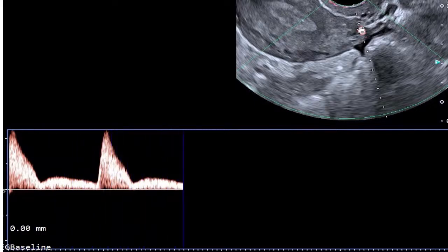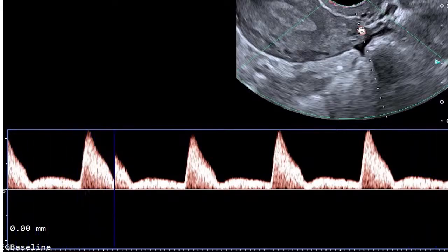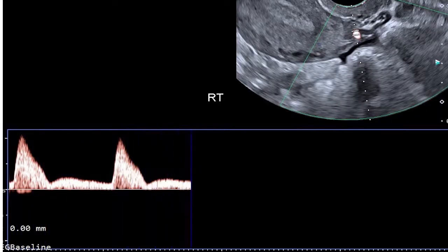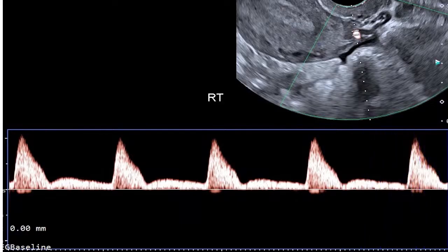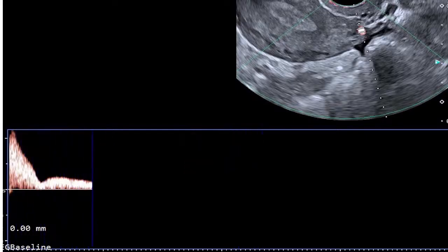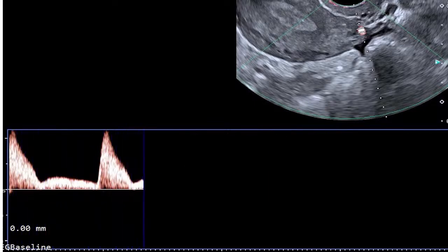I am not going to say a lot, but I need us to know that we are now entering a new era of reproductive medicine, where we can visualize fertility success before it happens by using uterine artery Doppler to assess endometrial blood flow. We can now identify specific resistance patterns that might be preventing you from staying pregnant. So we are going to break this down in the theory section.